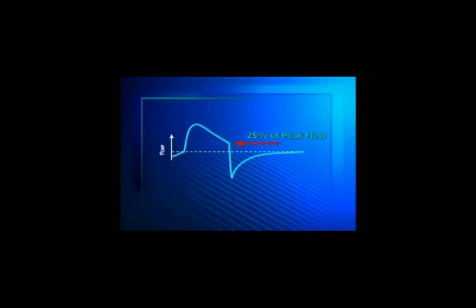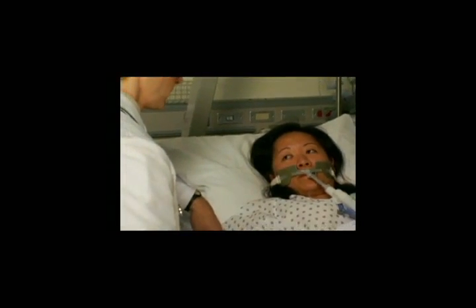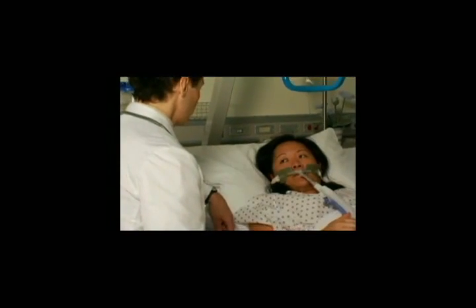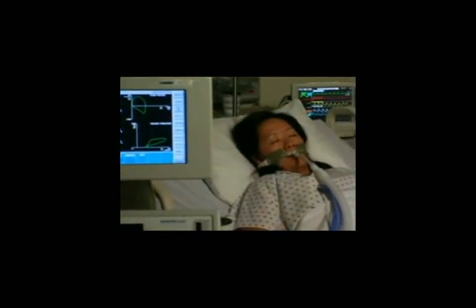It is important to remember that when designing pressure support, there was no physiological reason for choosing a 25% cycling off threshold. The old promise that this magic 25% number would allow patients to have freedom or good control over the machine inspiratory time is not true. An ideal expiratory threshold setting allows pressure support breaths to cycle off simultaneously with the patient's transition from inspiration to exhalation. Late or early cycling off can result in dyssynchrony.